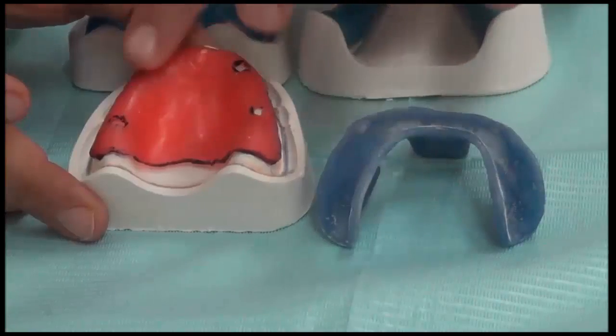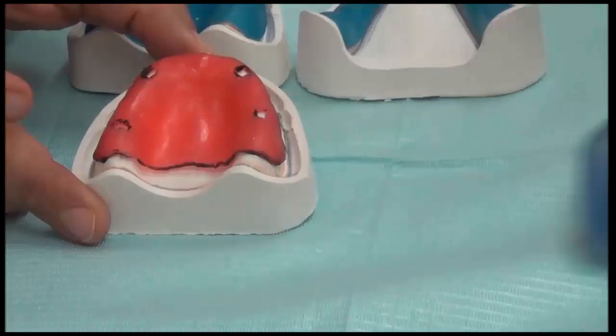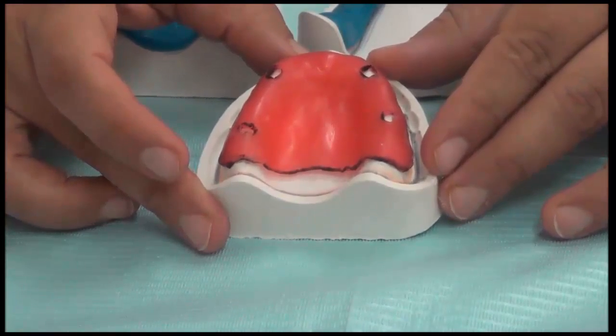But in the cases where we take an impression with a full relief, the denture, while functioning, will be put on the tissue while in resting position.